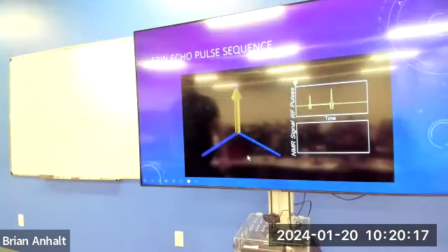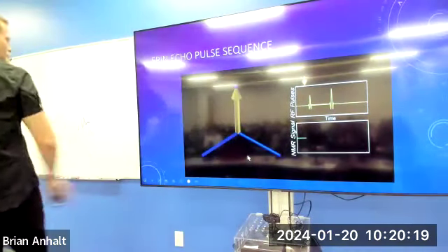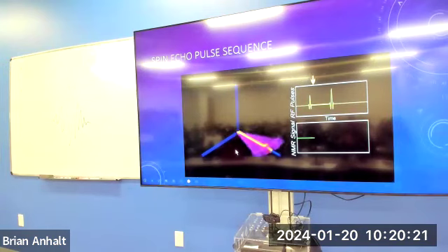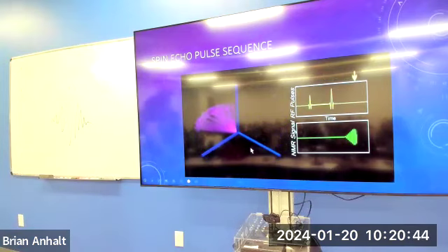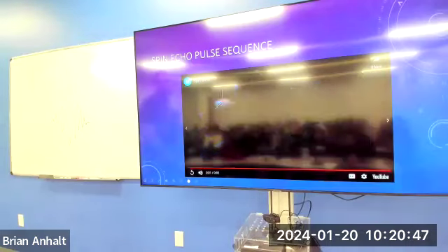Okay. 90-degree excitation pulse, boom, push the longitudinal magnetization into the transverse plane. Immediately it starts to decay away, so they're out of phase. If we were to measure at this time, we see the signal diminishing due to inhomogeneities and susceptibilities. They get out of phase, it tends towards zero, and then we flip them around the other way. In the rotating frame of reference, the fast ones catch the slow ones, and there we go. That's sort of bada bing, bada boom, they refocus, and we measure now, the signal comes back. And if we let it go further, the signal goes away again.